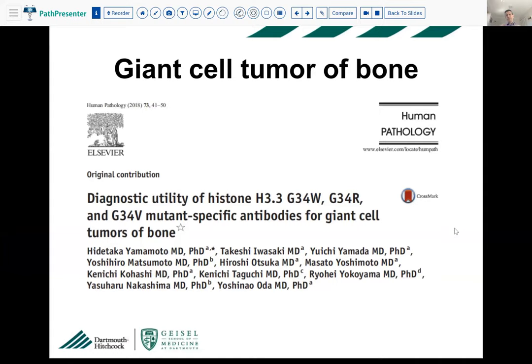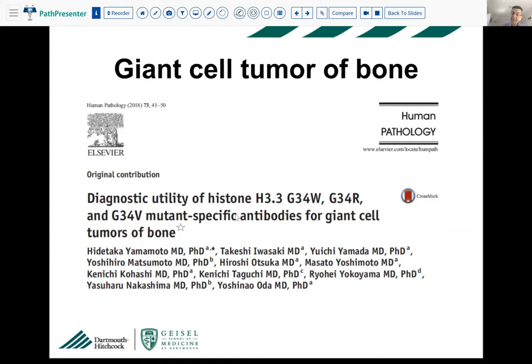One stain gives the diagnosis here: it shows nice, strong, nuclear, convincing, unequivocal positivity in all the spindle cells. The osteoclast-like giant cells and histiocytes are completely negative — a perfect internal control. This is a giant cell tumor of bone with fibrous histiocytoma morphology, which is well described in the literature. The molecular drivers for giant cell tumor of bone are mutations in histone H3.3 — most commonly G34W — with papers reporting 60-90% positivity depending on methodology. G34R and G34V also occur. There are immunohistochemical stains for all these mutations.